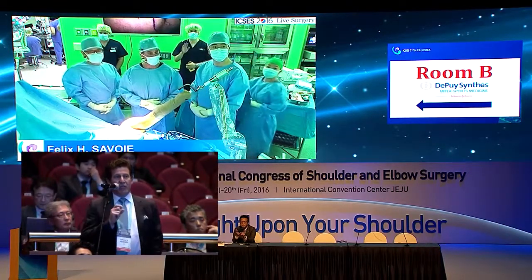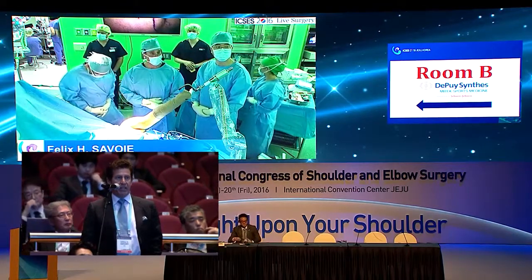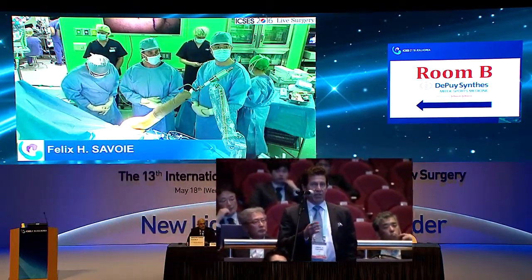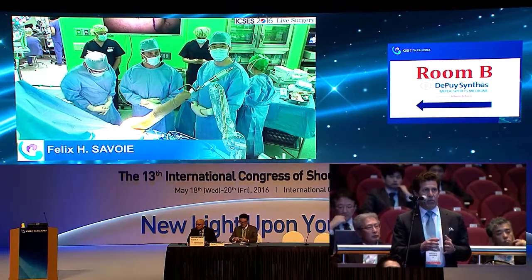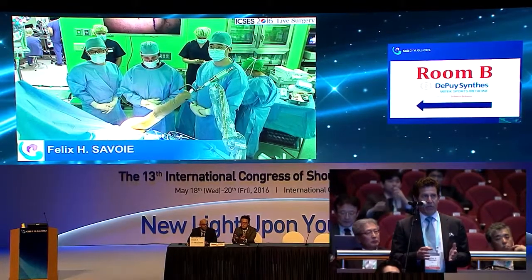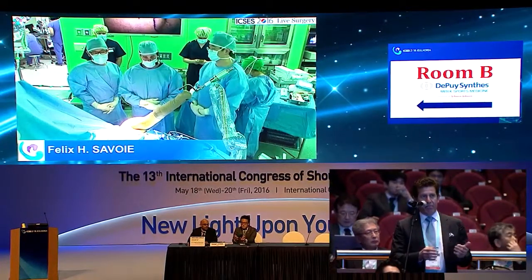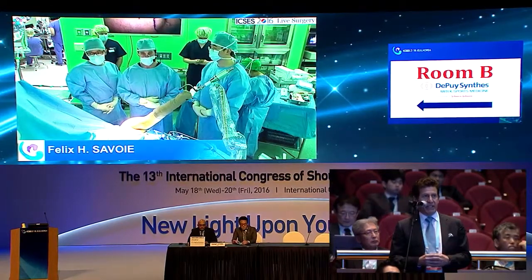Thank you. Spacing between holes. So you had a medial anchor, and then you decided laterally. You went a little bit anterior and a little bit posterior. Do you have an opinion of what's the minimum amount of space between your anchor holes, and whether or not they have to line up perpendicular to your repair, or do you like to oblique them like you did today?